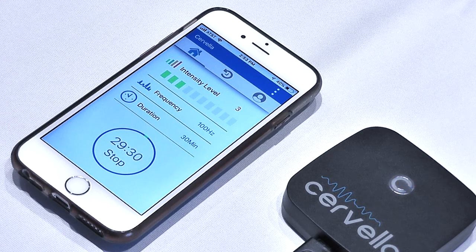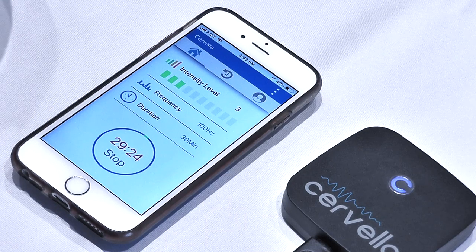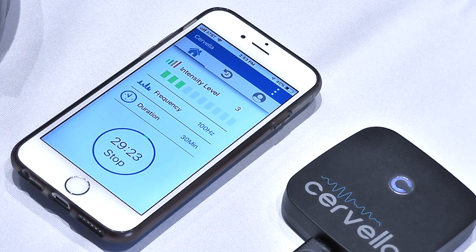If the tingling sensation is uncomfortable even at the lowest setting, it usually means that there is not enough conductive gel between the skin and the electrode contact patch. Note: you should never adjust the treatment level so that the tingling sensation is uncomfortable or painful.